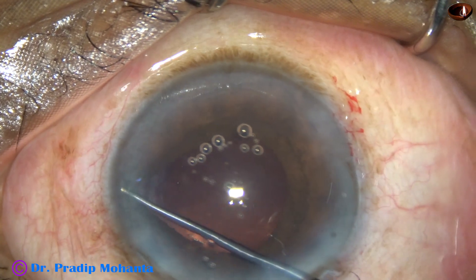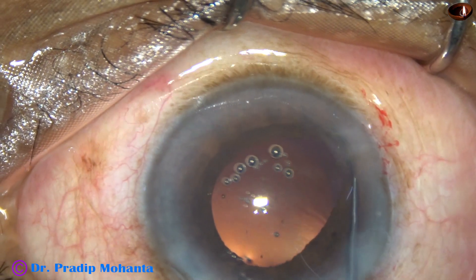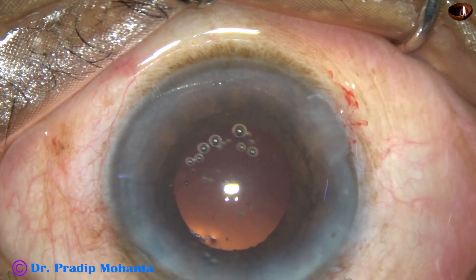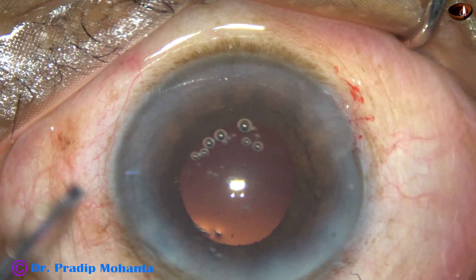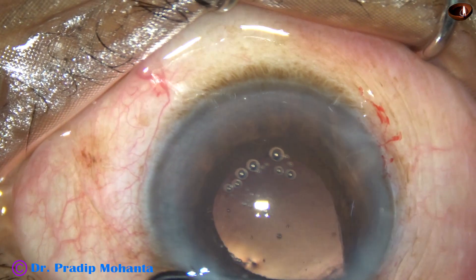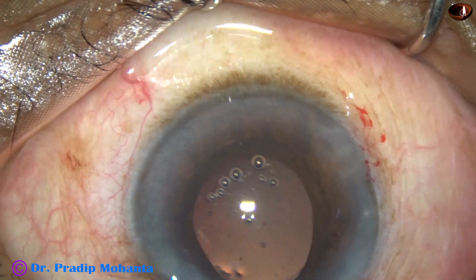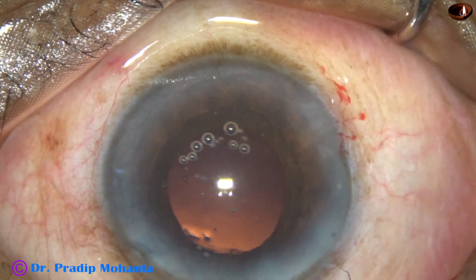Now viscoelastic is injected to fill up the anterior chamber. The iris is retracted to see if there is any cortex remaining anywhere — we go through the side port and examine 360 degrees. And there is no cortex.